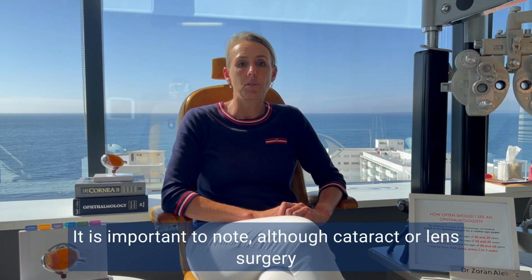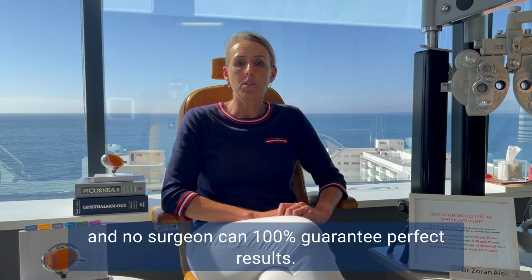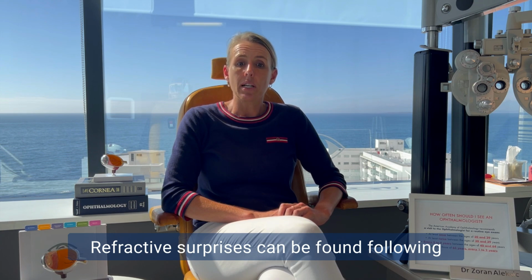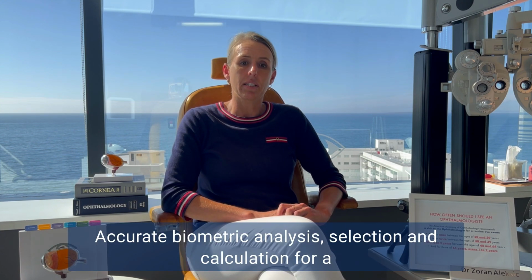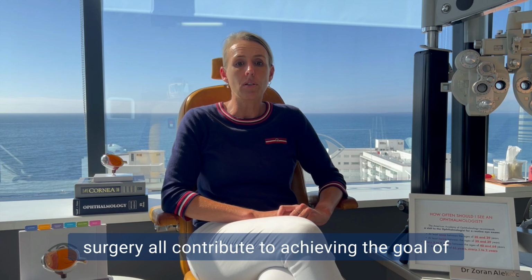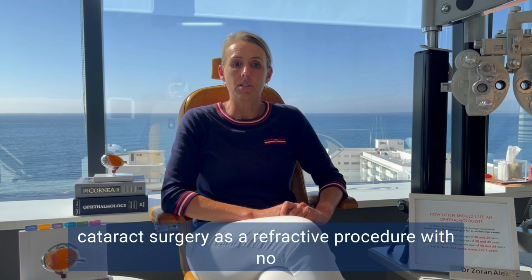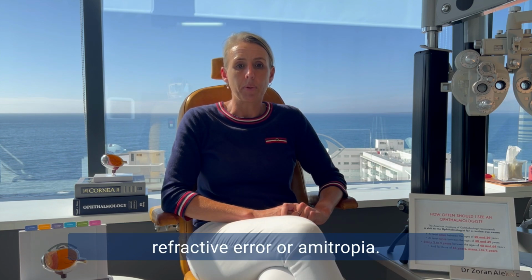It is important to note, although cataract or lens surgery is very safe and predictable, it is not without risks and no surgeon can 100% guarantee perfect results. Refractive surprises can be found following cataract surgery and refractive lens exchange. Accurate biometric analysis, selection and calculations of the adequate intraocular lens, and modern techniques for cataract surgery all contribute to achieving the goal of cataract surgery as a refractive procedure with no refractive error or ametropia.